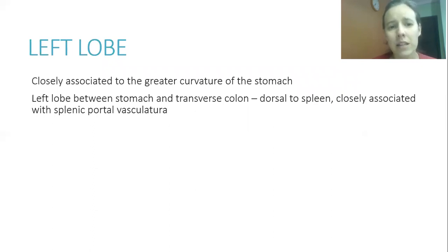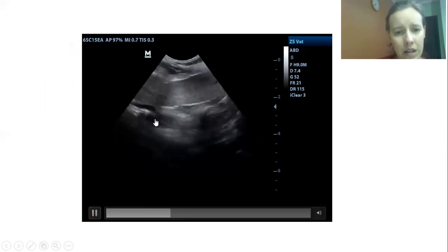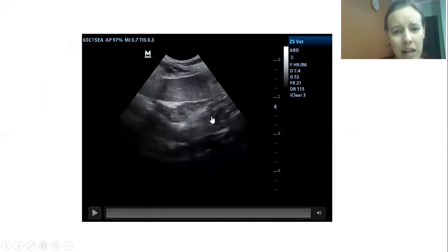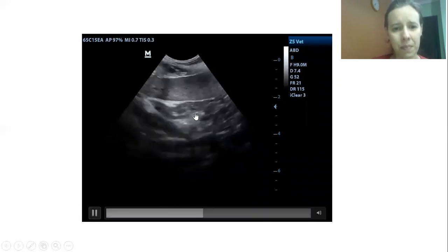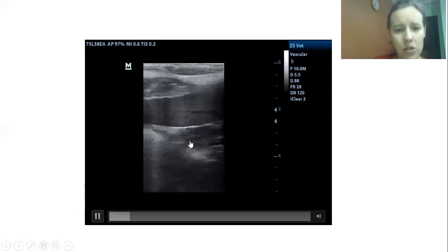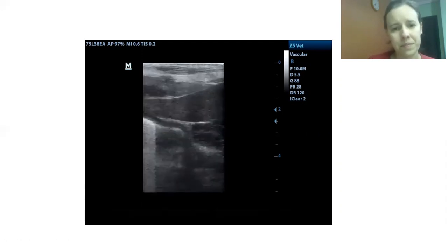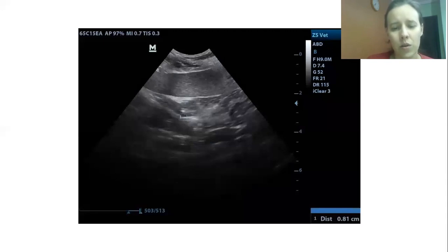The left lobe is closely associated with the greater curvature of the stomach, seen between the stomach and the transverse colon. It is dorsal to the spleen and closely associated with the splenic vascular structures. With the micro-convex transducer, you can see the spleen, the stomach, the colon, and the left lobe of the pancreas. With the linear transducer, it also shows up here near the stomach, measuring approximately 0.8 cm.